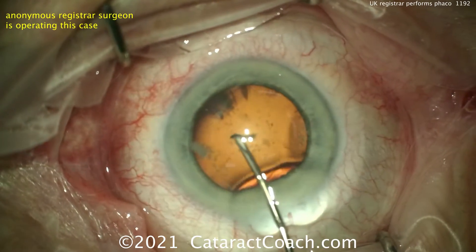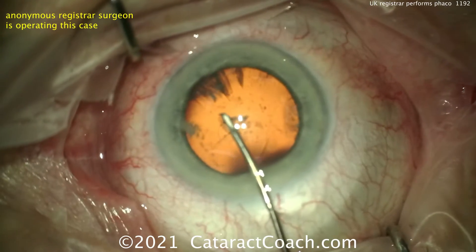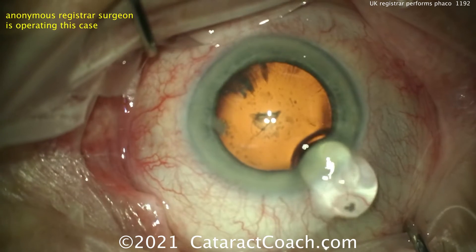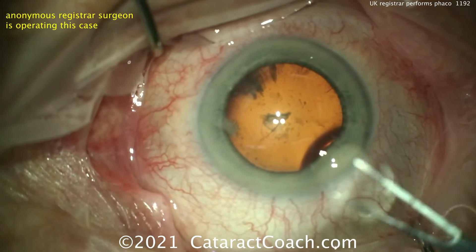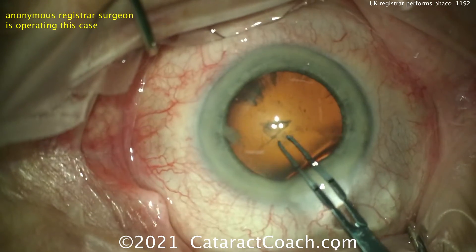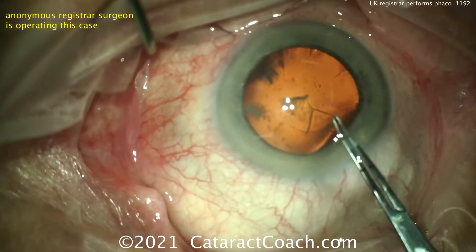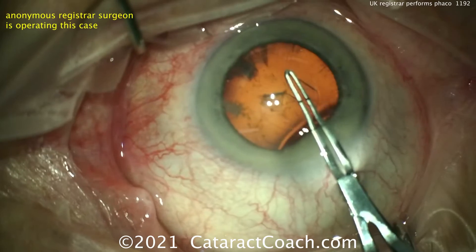So here using a cystotome to start the rhexis, and flipping over that edge looks pretty good. It looks like that cystotome was on the viscoelastic handle, so that's helpful. Here are some forceps similar to mine, marked off at 2.5 and 5 millimeters. Let's see the pivoting technique — very nice, good pivoting.